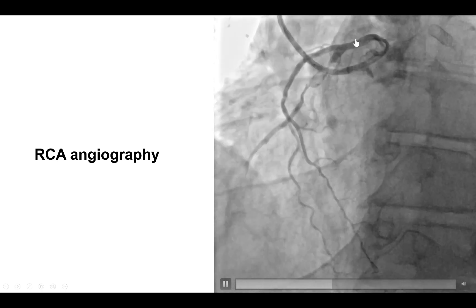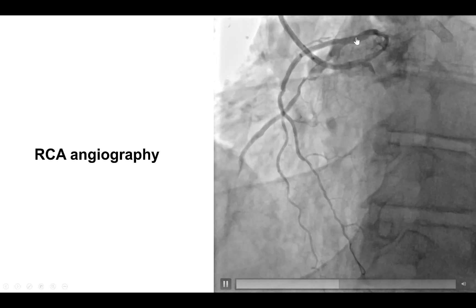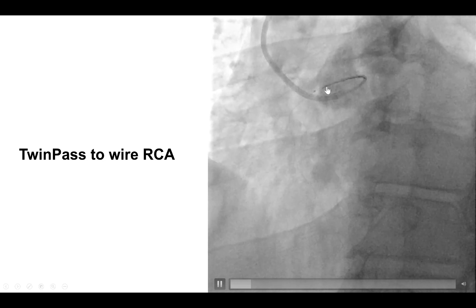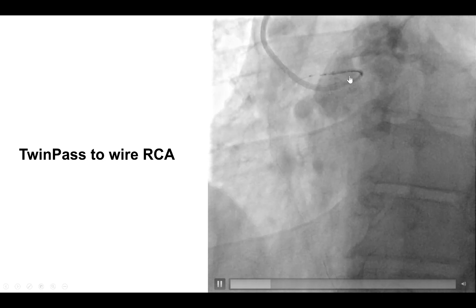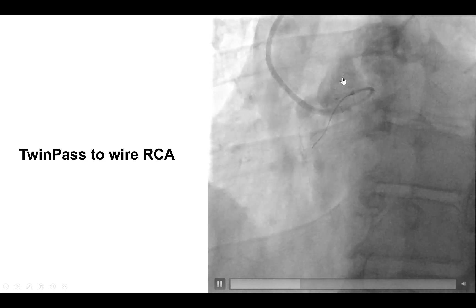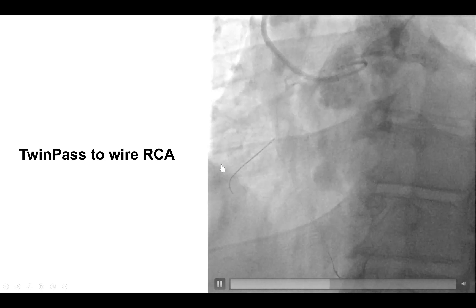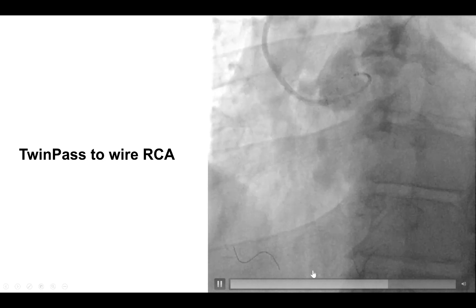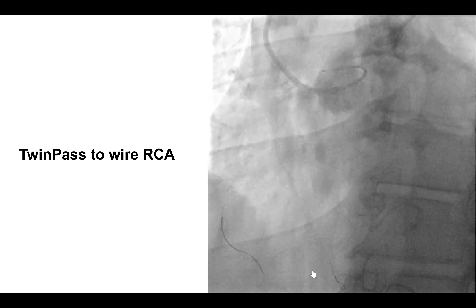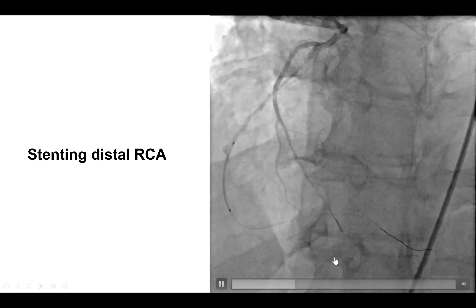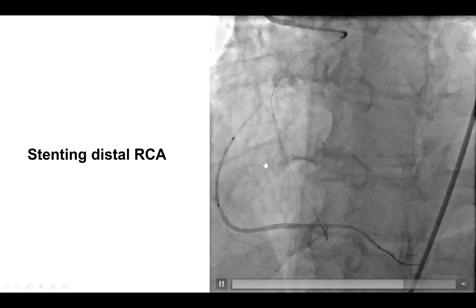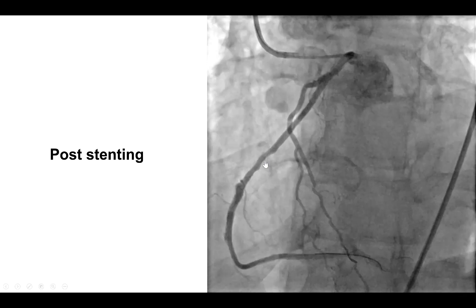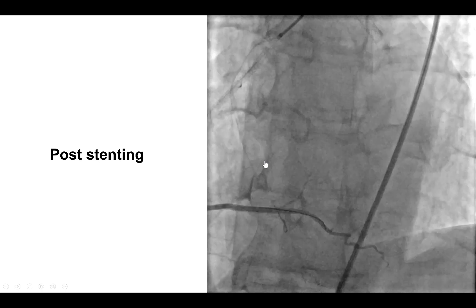The challenge now was to wire into the right coronary artery. This was done by pulling back the guide extension and using a dual lumen microcatheter — the Twin Pass Torque. A workhorse wire was advanced through the over-the-wire lumen of the Twin Pass and successfully advanced all the way to the distal right coronary artery. Stents were subsequently placed in both the distal as well as the proximal right coronary artery, providing a nice result with TIMI flow into the right coronary.